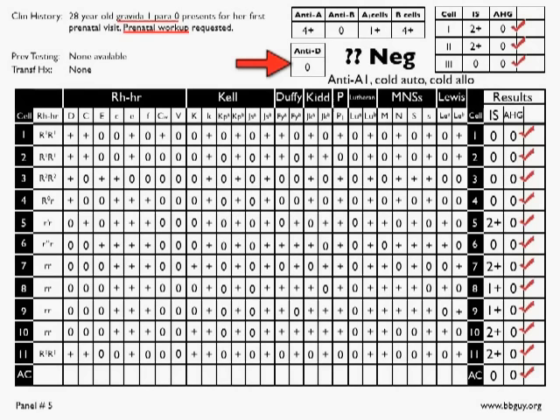But in addition, you should also be thinking about regular cold autoantibodies reacting non-specifically against the A1 cells, but also a cold alloantibody, meaning an antibody against someone else's red cells that reacts against those same antigens on the reagent cells. So again, more on that in just a few minutes. But those are the things you should be keeping in mind.